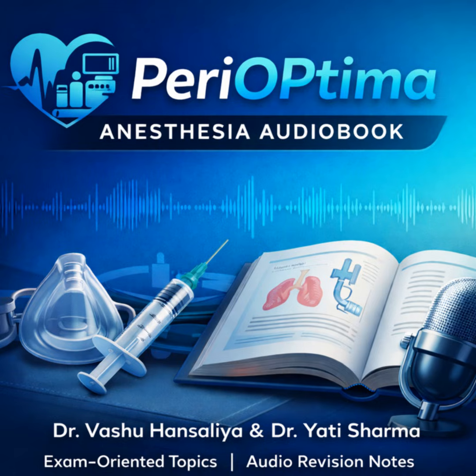Okay, let's dedicate this next section to the critical complications and safety considerations that every anesthesiologist must have memorized. Let's start with the big one again, dental trauma. This is the number one reported mechanical complication of DL. And it's almost always preventable. It is. It happens when you misuse the teeth as a fulcrum instead of applying that clean, perpendicular lifting force. Curved blades are generally a bit safer in this regard than straight blades.